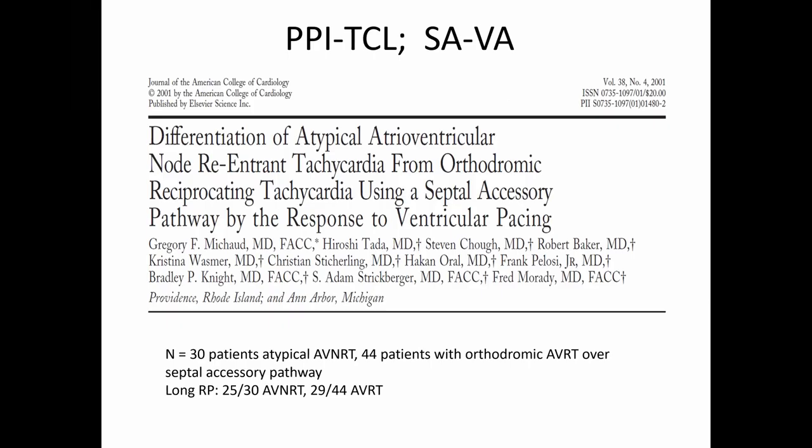So the next thing to just mention, which is quite critical in terms of differentiating SVT in the EP lab, is the response post-entrainment, which is the post-pacing interval minus the tachycardia cycle length, and also looking at the stimulus to the A to the VA time in tachycardia.